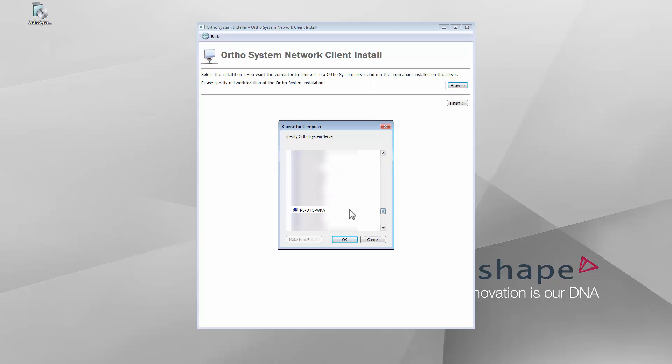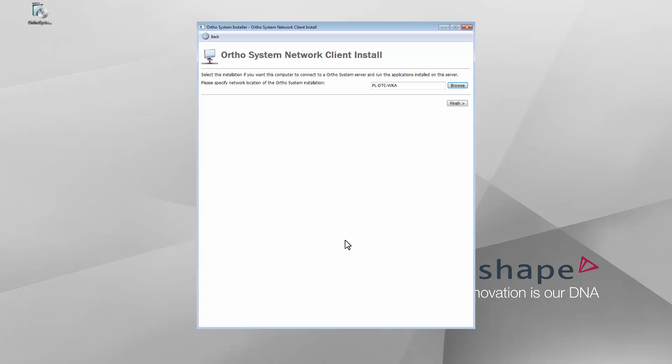Find and select the server PC, which contains OrthoSystem. Click OK. Click the Finish button. The Ortho applications will now be installed.